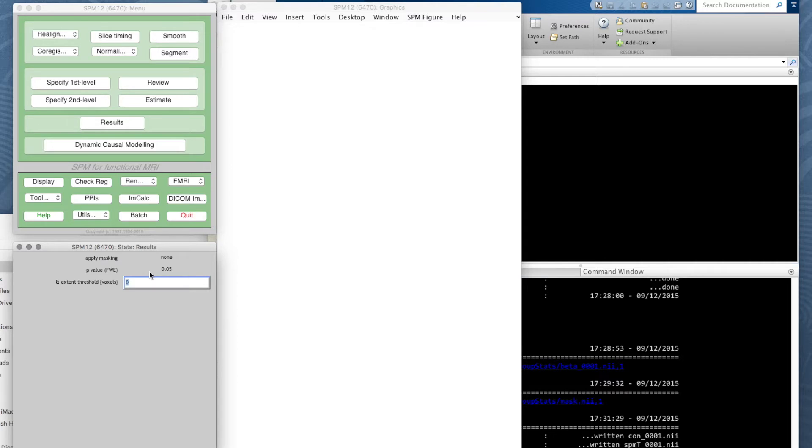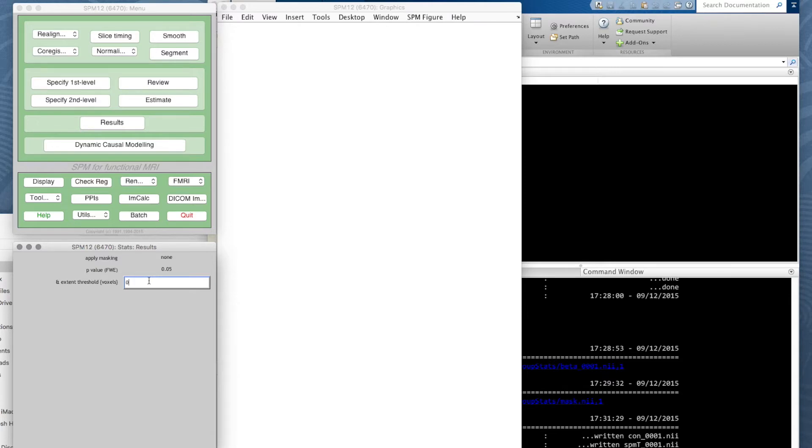The other threshold it wants to know about is the extent threshold, and this is so that we can choose to only show those significant voxels that are part of larger clusters of significant voxels.